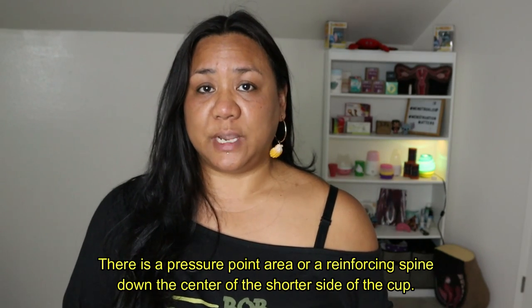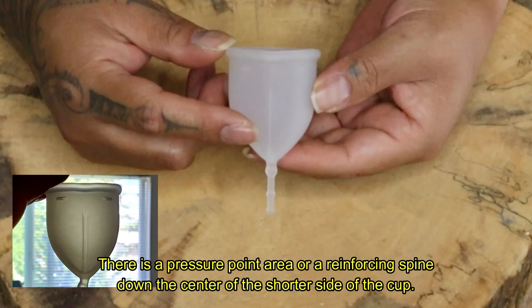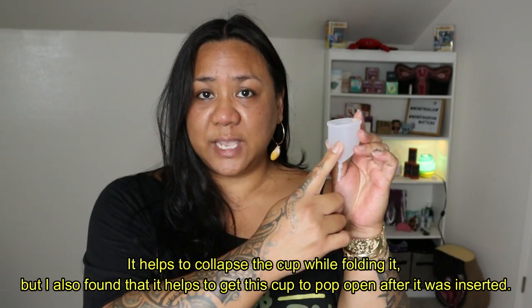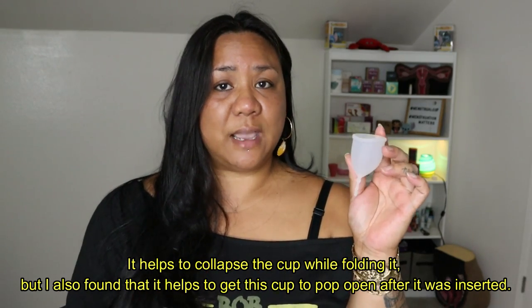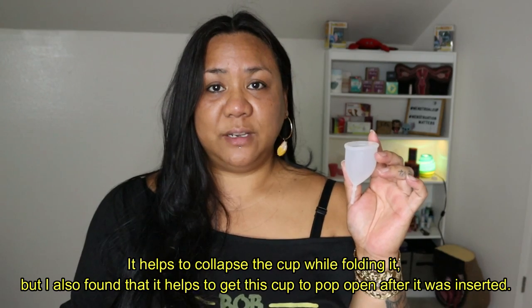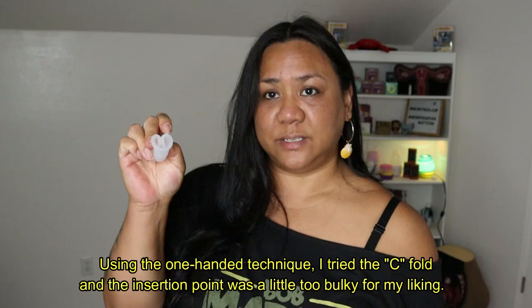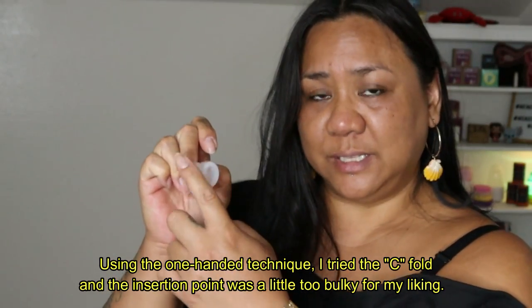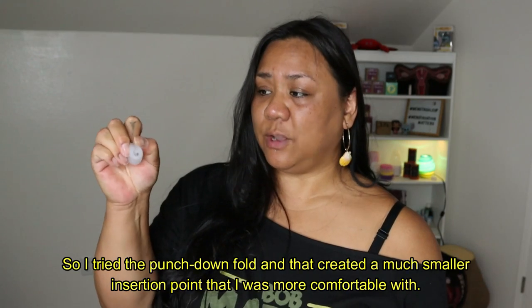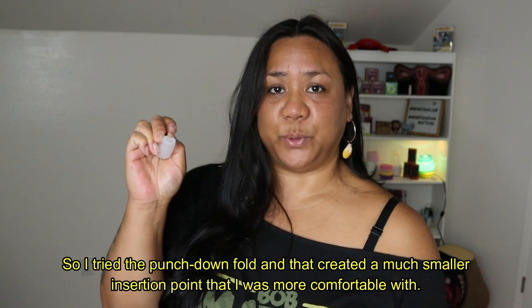There is a pressure point area or a reinforcing spine down the center of the shorter side of the cup. It helps to collapse the cup while folding it, but I also found that it helps to get this cup to pop open after it was inserted. Using the one-handed technique, I tried the C fold and the insertion point was a little too bulky for my liking. So I tried the punch down fold and that created a much smaller insertion point that I was more comfortable with.